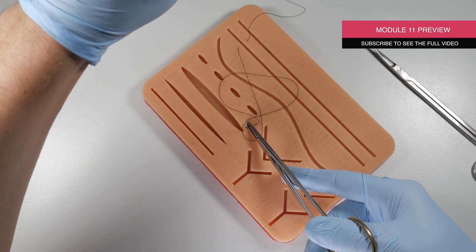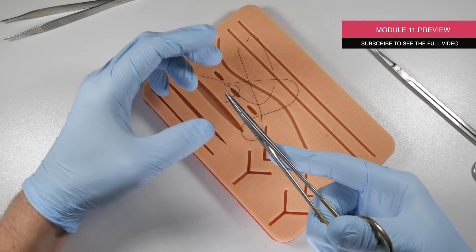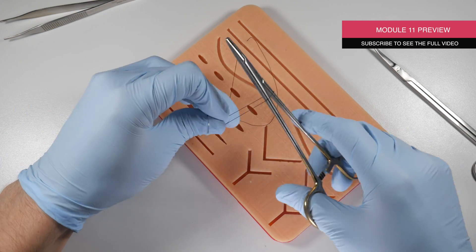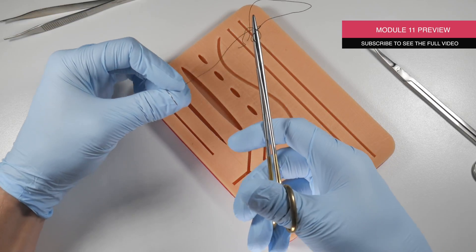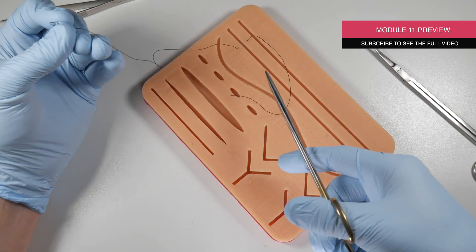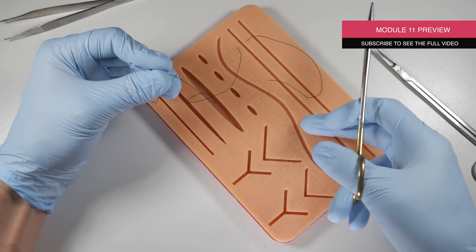Some people will leave this kind of like this, so it's way too long. The problem with this is when we go to try to tie our knot, we're trying to pick up this end here which is flopping all over the place, and it's just tough to get. Once it's in the mouth, it's even harder because it's going to be adhered on the tissues or dangling out of the mouth somewhere.